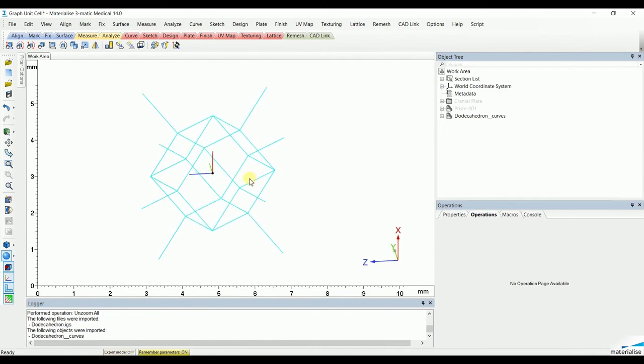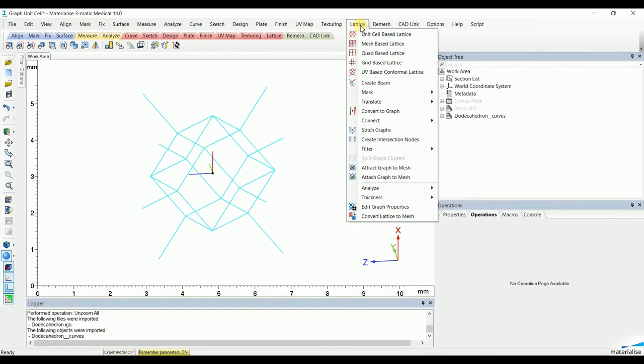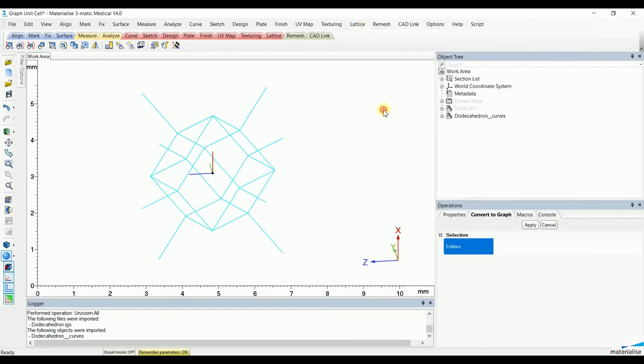The only thing to do is to go to lattice, go to convert to graph, and transform all the curves in that file to a lattice structure.